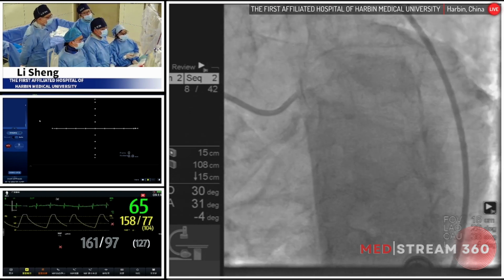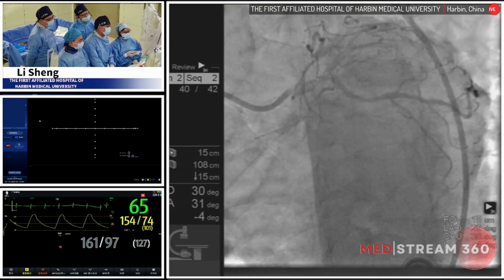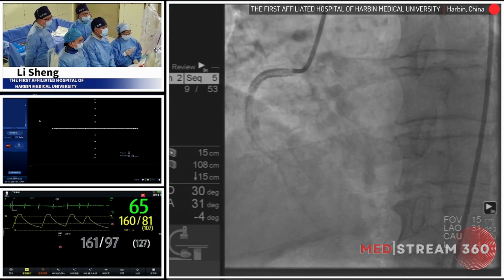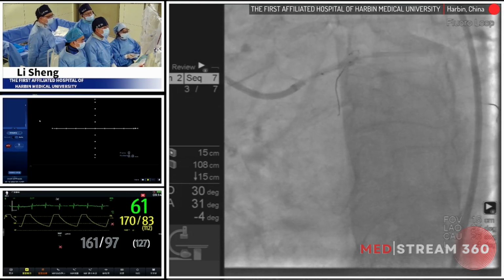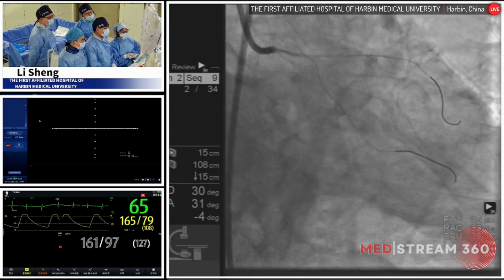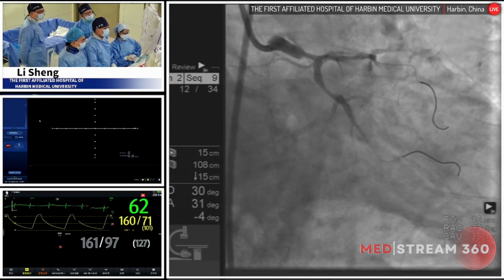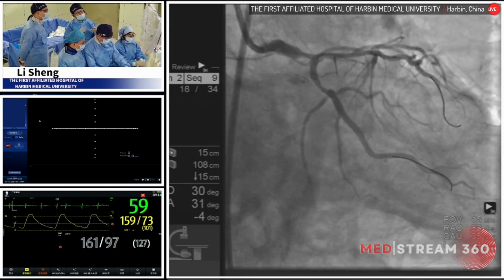This is today's coronary angiography. Left distal left main severe stenosis. This is cranial position angiography. This is the RCA results. Okay. Just now, Dr. Shi has put two wires advanced to LAD and LCX, and we use the compliant balloon to predilate at the distal LM. All right. Okay. But I think after the pre-treatment, the stenosis in LM looks much better.